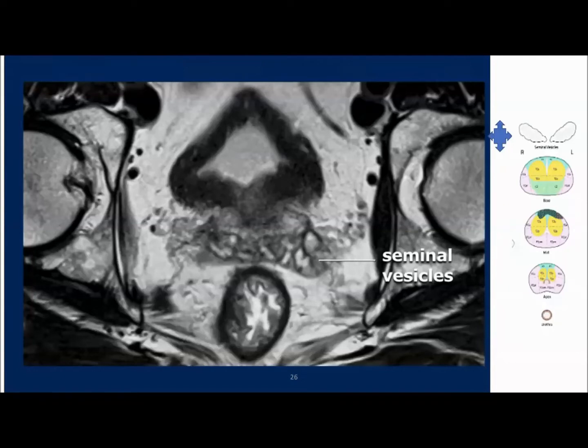Most of you know that we have the PIRADS scale or grading system, and it's extremely important to understand PIRADS, which urology colleagues often have difficulty understanding and using to categorize patients into the various PIRADS categories.